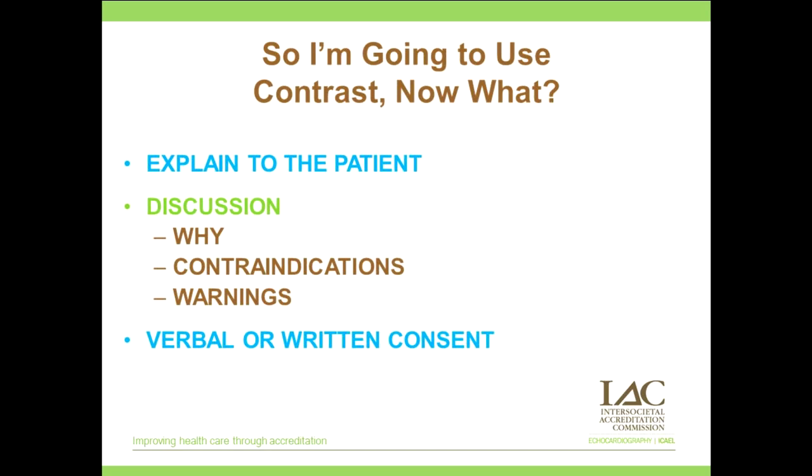If you're going to use contrast, a consent is needed. And this can be either a verbal consent, where the patient agrees verbally, or you can have a written consent. If you choose to use a written consent, those adverse events that may potentially occur, instead of discussing them with the patient, can be part of, and should be part of, the consent. And again, this will all be lab dependent.